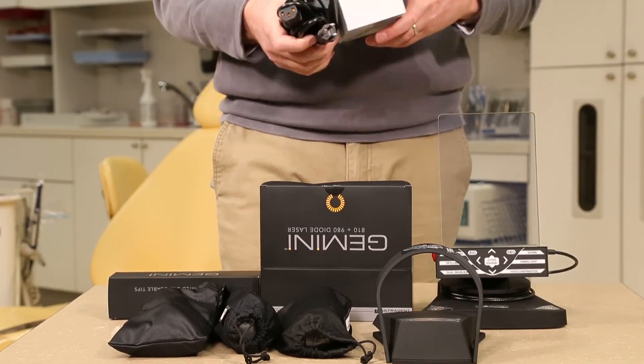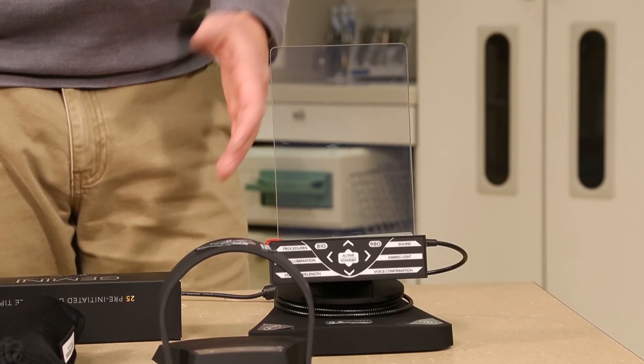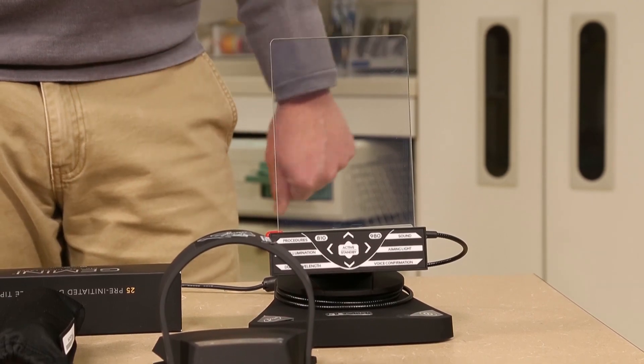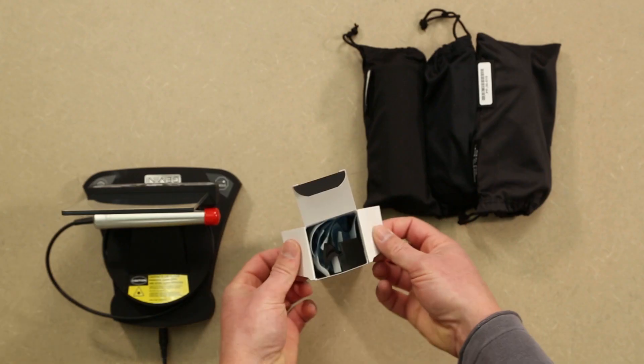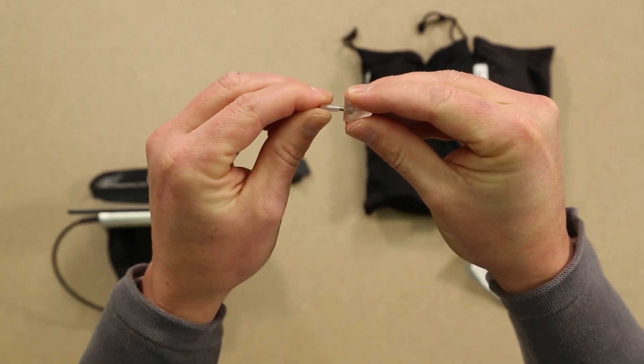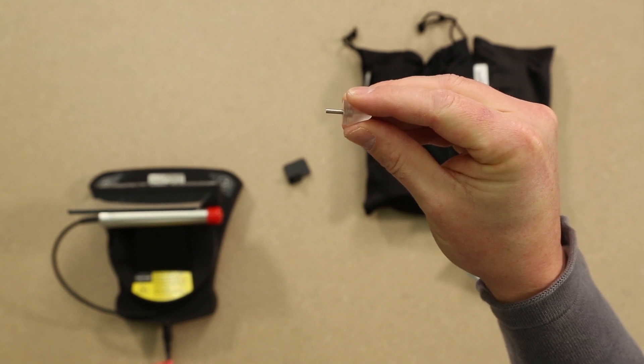Once the contents are unpacked, go ahead and plug in your laser to a power supply. Note that nothing will be displayed indicating power to the unit. Place the foot pedal on the floor and open the box of tips. Take one tip from the bag and remove the small plastic protector from the proximal end. Be careful not to touch this area with your fingers as any contaminant could interfere with the laser.